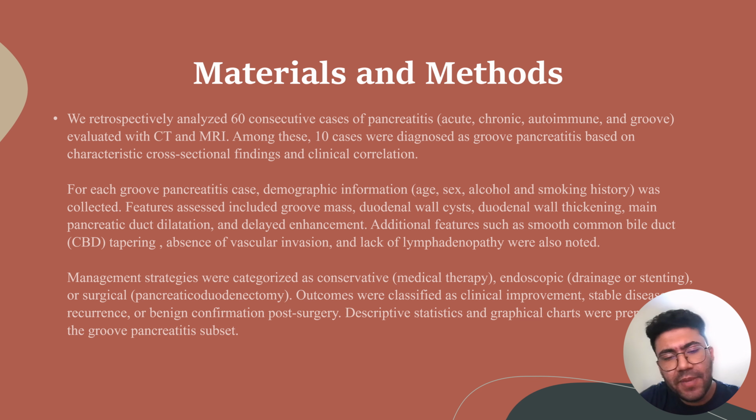60 consecutive cases of pancreatitis were retrospectively analyzed and evaluated with CT-MR. Amongst these, 10 cases were diagnosed as groove pancreatitis based on characteristic cross-sectional findings and clinical correlation. For each groove pancreatitis case, demographic information such as age, sex, alcohol, and smoking history was collected. Features assessed included groove mass, duodenal wall cysts, duodenal wall thickening, main pancreatic duct dilatation, and delayed enhancement. Additional features such as smooth common bile duct tapering, absence of vascular invasion, and lack of lymphadenopathy were also noted.